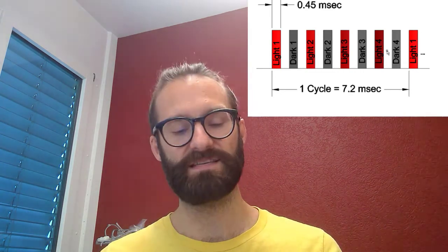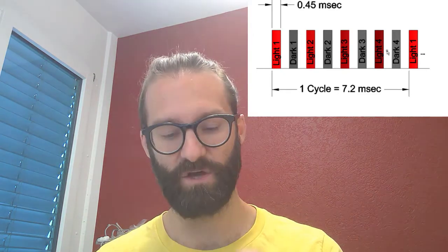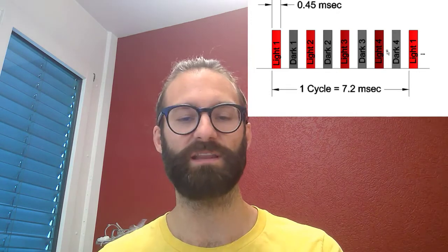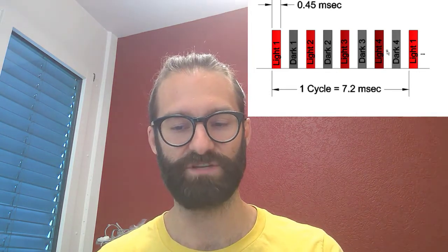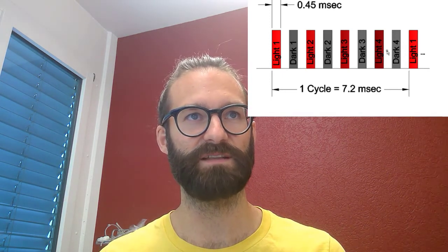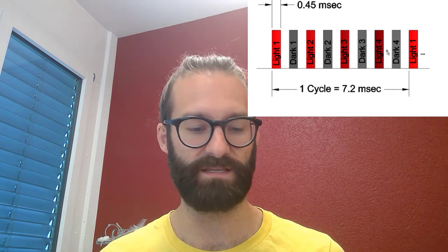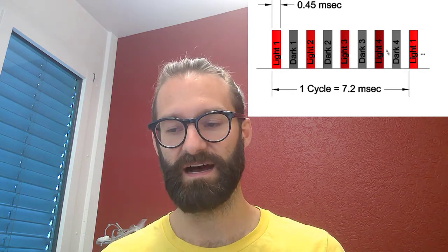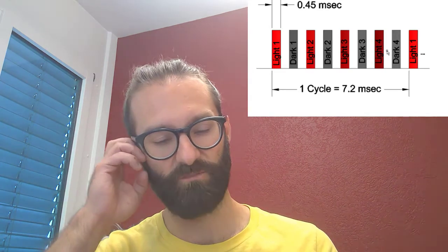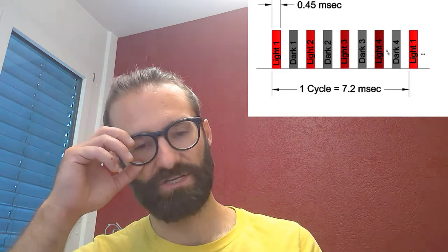So yes, the update rate that you're getting is only at a half hertz, but really there are a lot more LED cycles happening to average out this data. It makes the signal more robust. So there's advantage and disadvantage. Update rates are kind of slower, even though most people end up smoothing this data a ton anyways. In certain cases, it can be a little frustrating not to have faster ones. Again, you can put it to 2 hertz. But just quickly, that's the raw data remark I wanted to add.